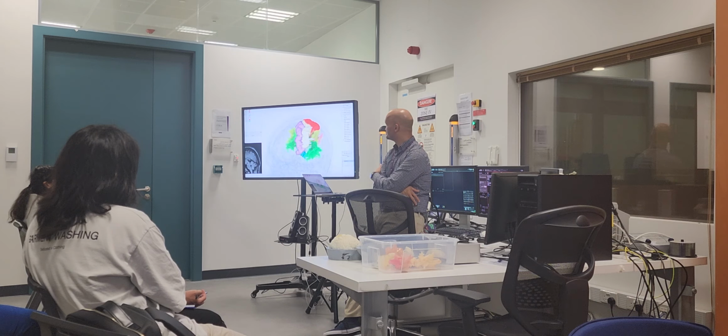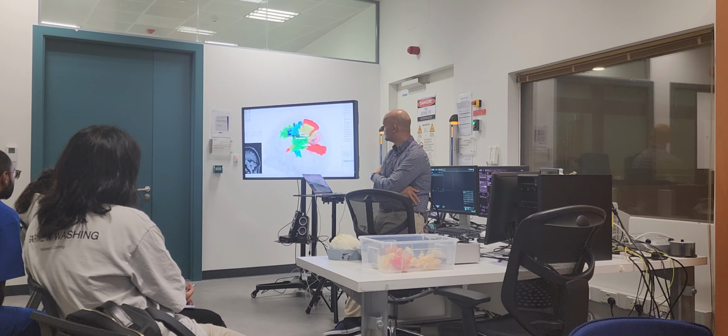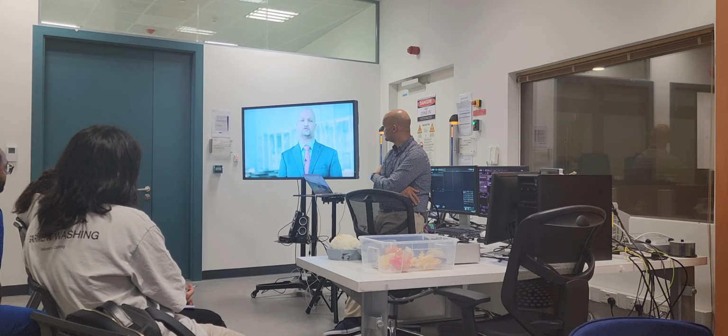For this patient, we deployed the third advanced modality, which is called diffusion tractography, which maps the white matter fiber bundles in the brain, or if you will, it's just the highways that connect the different functional areas in the brain.